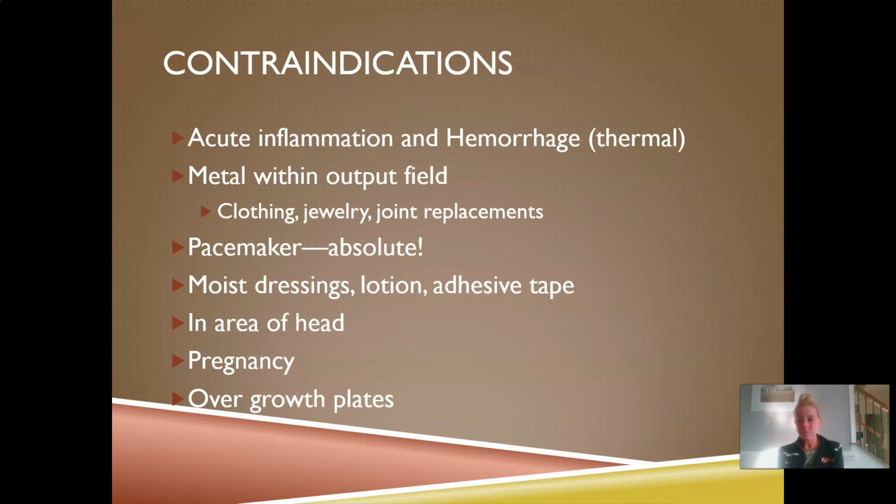And joint replacements we need to use some caution with. Joint replacements are typically deep within the joint, and we're probably not going to be able to get to them with diathermy. The other thing is most joint replacements are made with types of metal alloys that are not going to respond to heat too well, and I do know that patients who have had joint replacements have had diathermy, but we do want to be cautious with that.